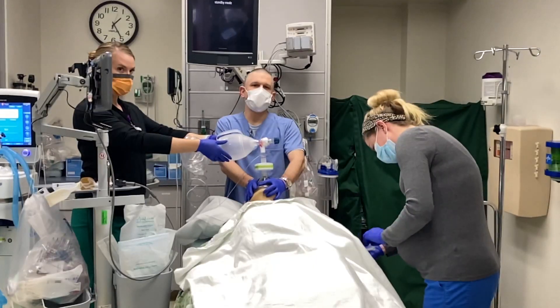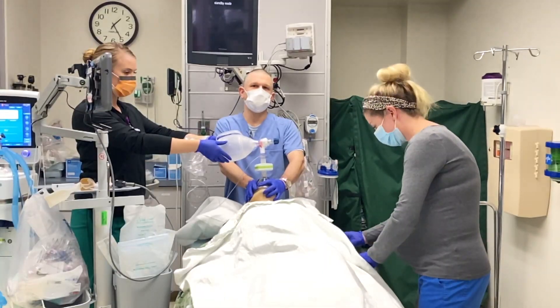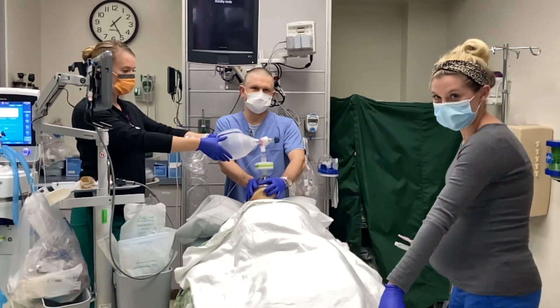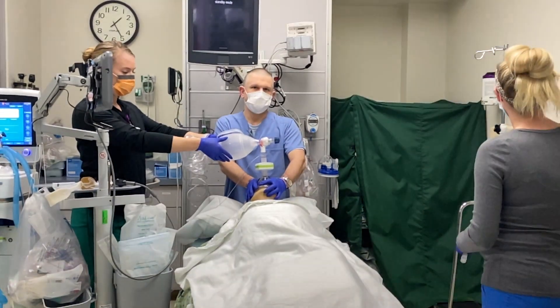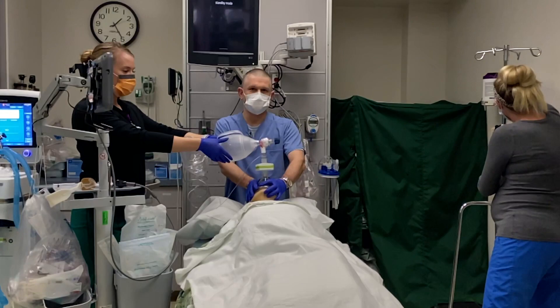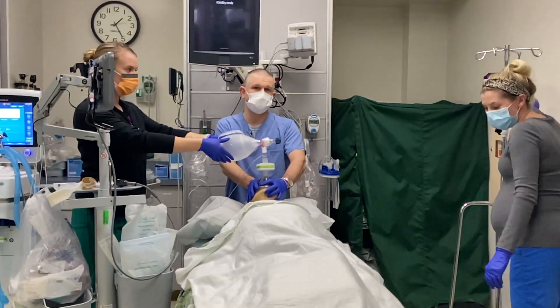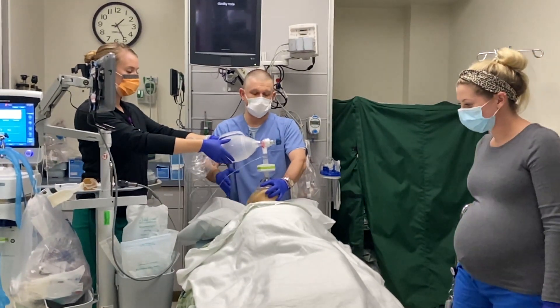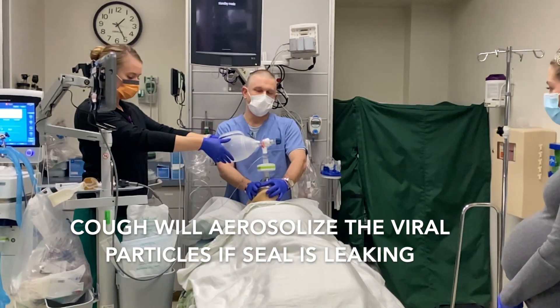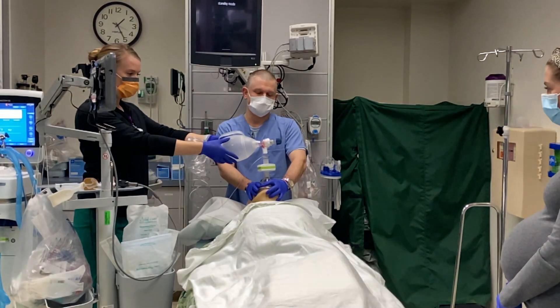Now the key is we're going to wait until the patient is paralyzed. We can't be too quick here, because it's going to be important that there's no cough or aerosolized particle contamination problems.